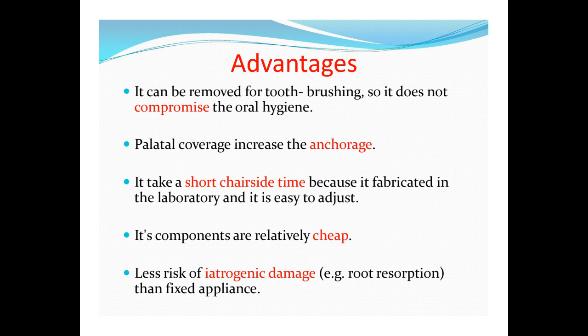It takes a short chair side time. Patient comes to your clinic, you take an impression, that's it, and you send the patient. All the processing is done in the lab, so the patient does not have to sit in your office till the appliance is made. So it is a very big advantage. The components are very cheap because it uses very basic components like wire components and acrylic. So it is very cost effective for the patient, and there is less risk of iatrogenic damage.